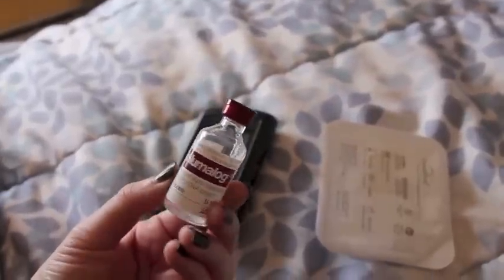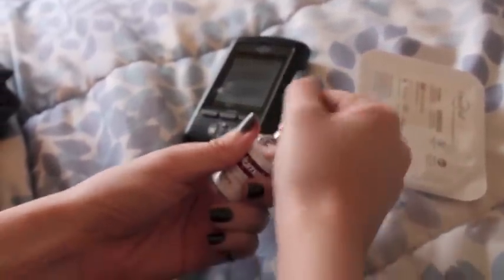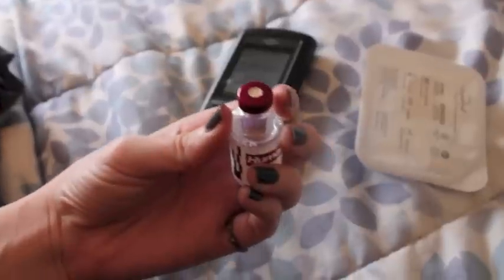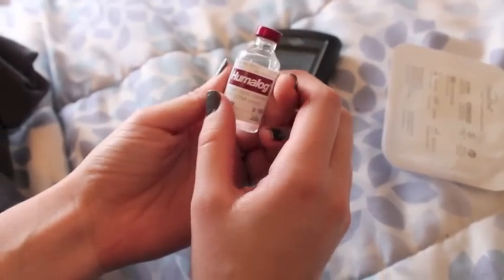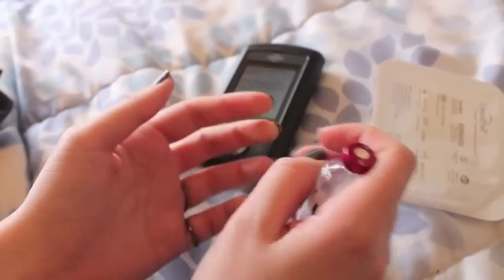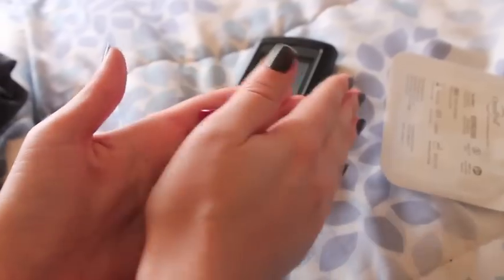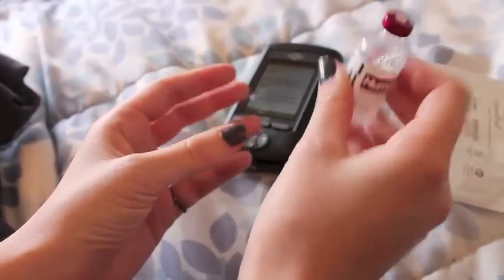So because this is a new bottle of insulin, we're gonna have to open it, and you do that just by pulling on the top like that. Also, if you have just pulled one of these vials out of the fridge, sometimes the Omnipod can be a bit sensitive to temperature, so you might want to warm the insulin in your hands a bit before you put it in the Omnipod. But this has been sitting out a bit, so it should be warm.